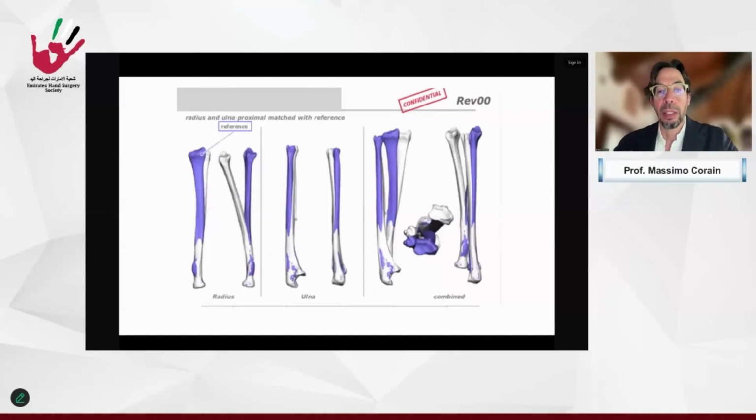And with that, compared with the contralateral, we detect exactly the point of deformity, the range of deformity, but I see that was an ulnar deformity too. We always have to consider in forearm deformity during a trauma, during childhood, that ulna too can have a deformity because of traction due to the interosseous membrane on the ulna caused by the deformity during a growing age.